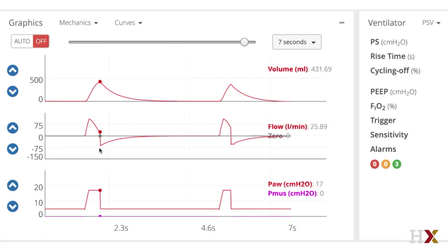which, in fact, if you see here the expiratory flow, there's a peak and it's exponential, whereas here there's a little bit of a dampening in the peak, and that's because the effort is actually still continuing even though the ventilator cycled off. This is a form of dysynchrony or asynchrony called premature cycling or short cycling. So the ventilator cycled off before the patient was done the effort.